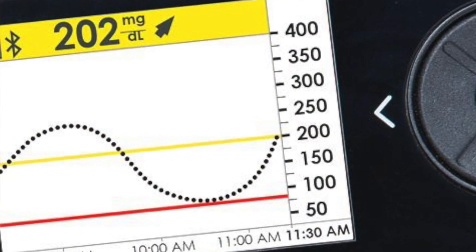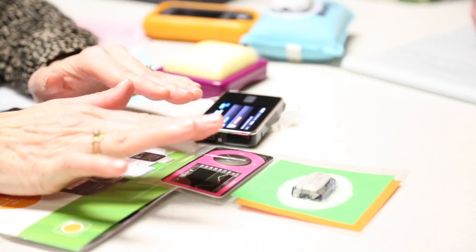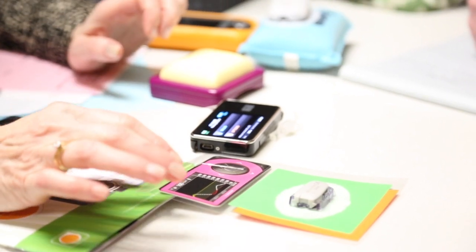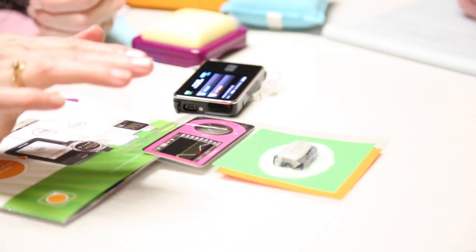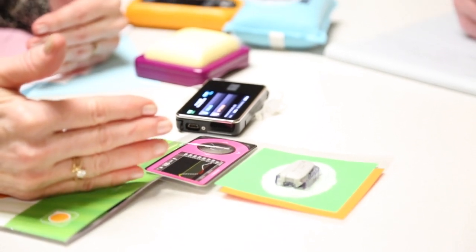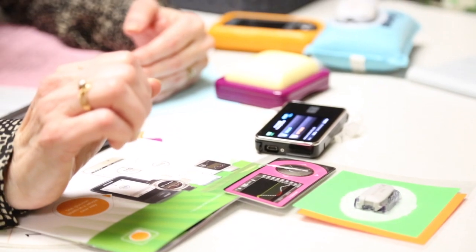Whether you're trending, especially with a pump, if you're trending up out of sight, maybe the pump insertion set is not working. If you're trending low, your blood sugar could be 140, but if you're dropping like a rock, that could give you good guidance as far as appropriating a snack before it gets down to 40, that sort of thing.